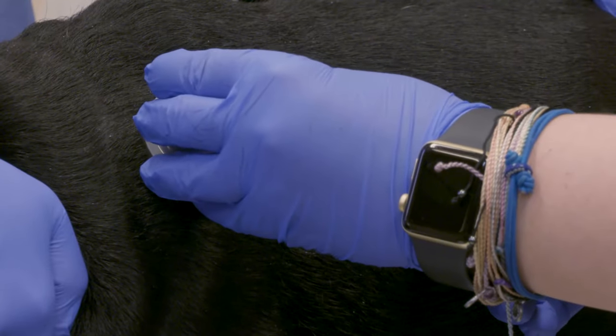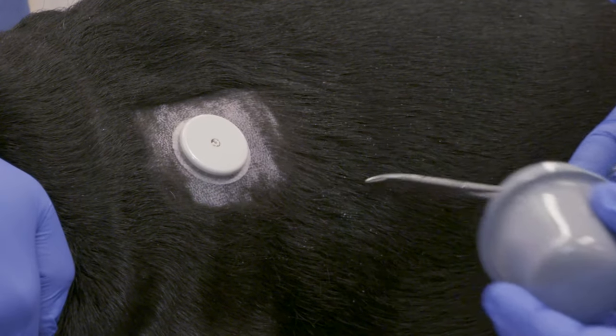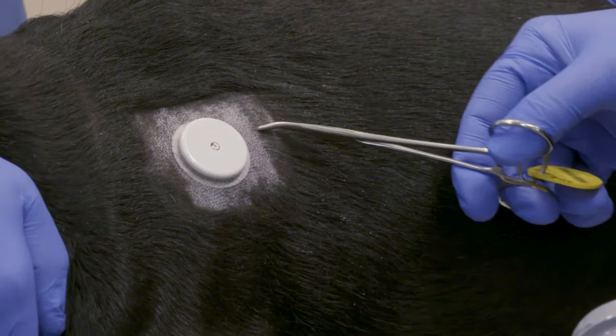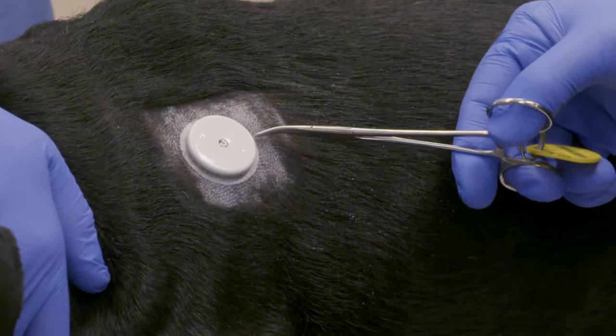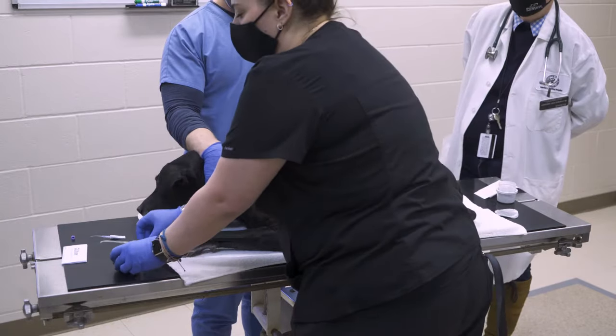Then gently remove the applicator from the sensor disc, taking care that the sensor disc remains on the skin and does not pull away with the applicator. Sometimes it is necessary to use a pair of hemostats to assist in retracting the applicator.